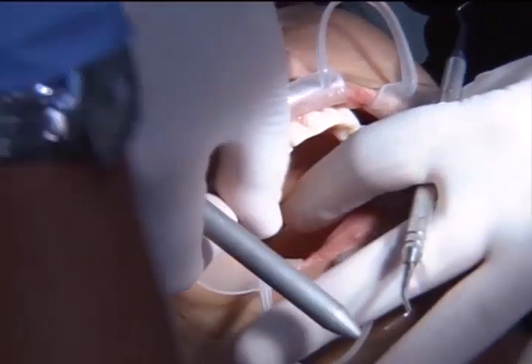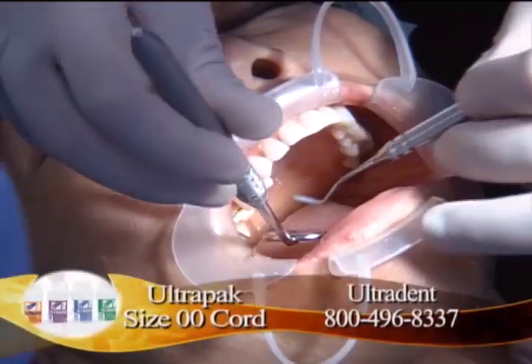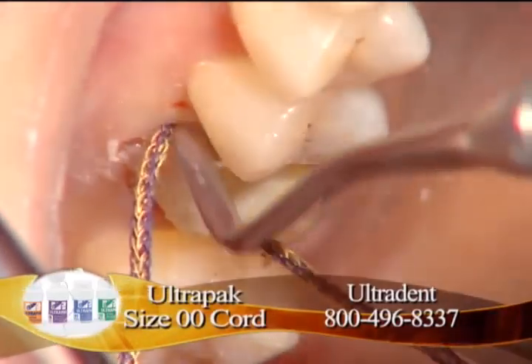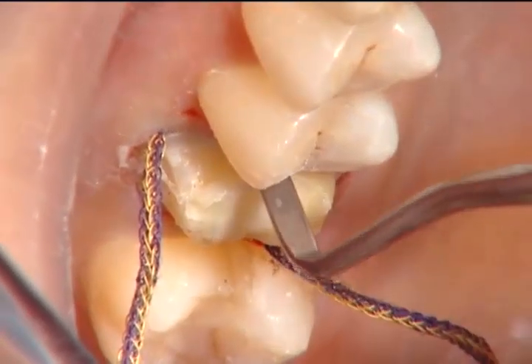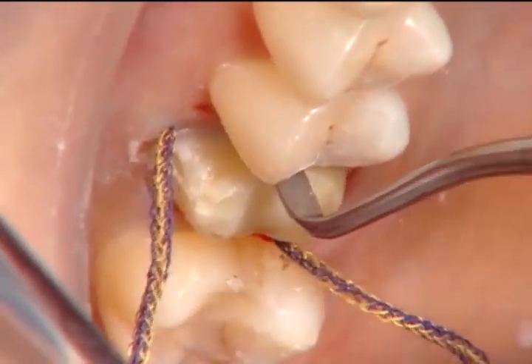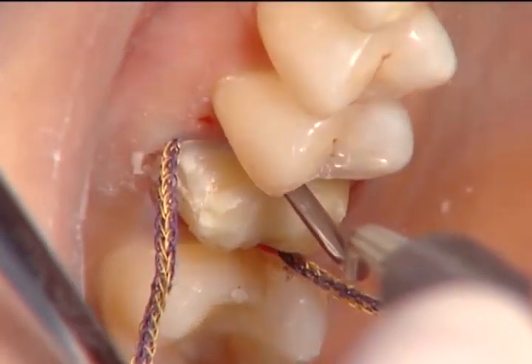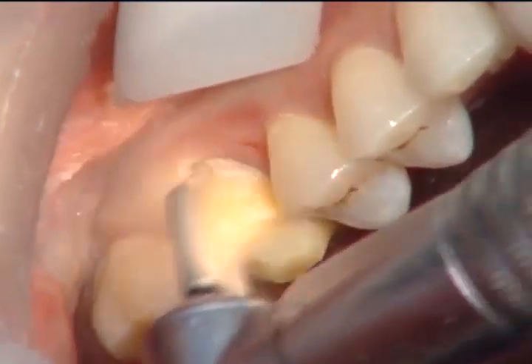Once we've just about finished the preparation, we're going to go ahead and place our double zero cord. Usually we would do this much earlier in our preparation sequence, our reverse preparation sequence. It's a DVD that's also available online and free from Glidewell Laboratories, but you really can't use the reverse prep when you're taking off an old crown. So at this point, we're placing our double zero cord into place, and now we're going to go finish our margins.